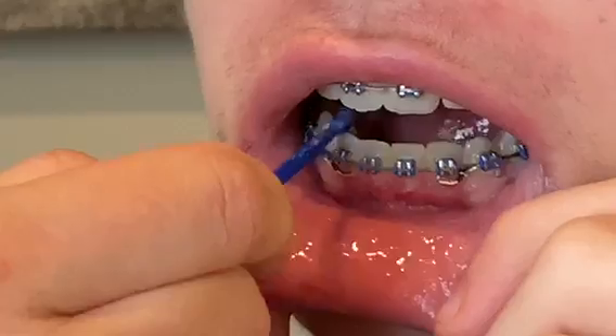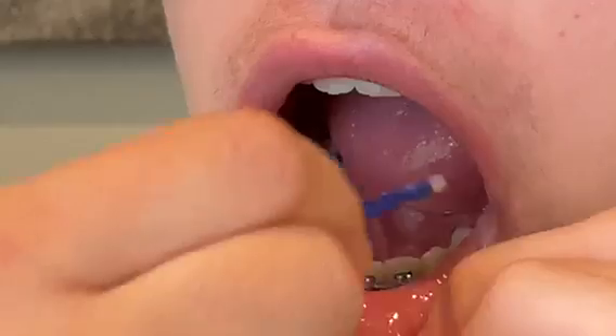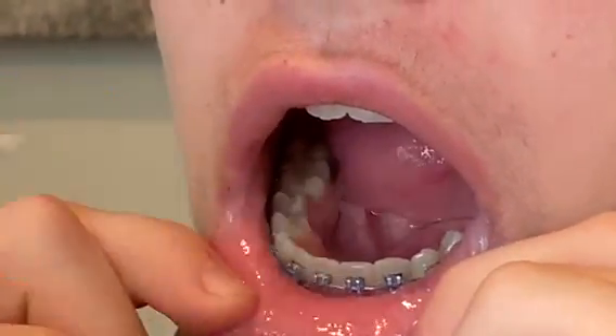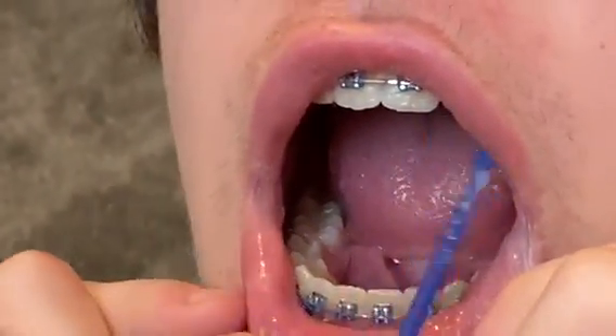And then you do it on the biting surfaces. So I'm just twirling around again. Open up all here.